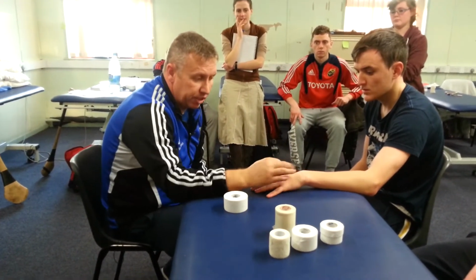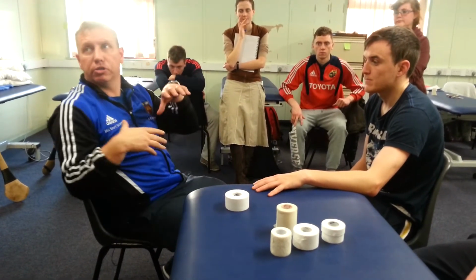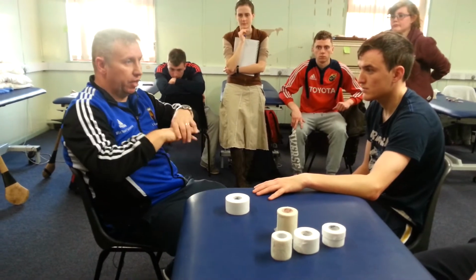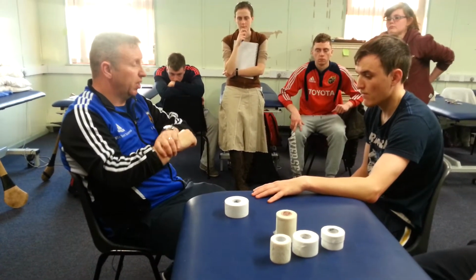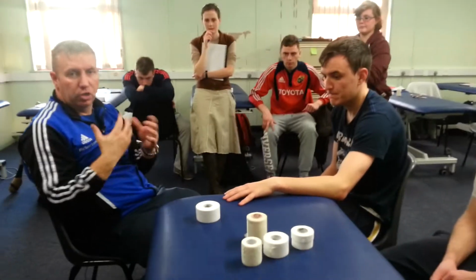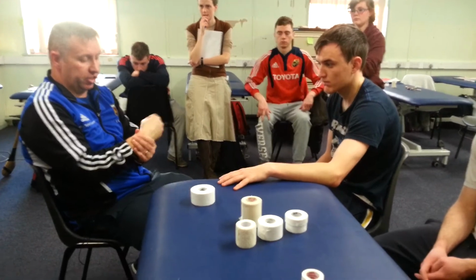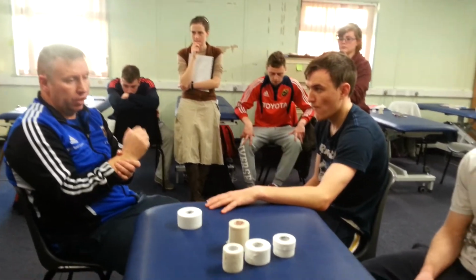You can do the same for the wrist. I tend to follow the boxers. Do you ever see the boxers before they put it into the glove? They have that hand and wrist strapped up. I tend to follow that format, to be honest with you. Now, that's just for an ordinary person that just wants their wrist stabilised in flexion or extension, just to create that stability.